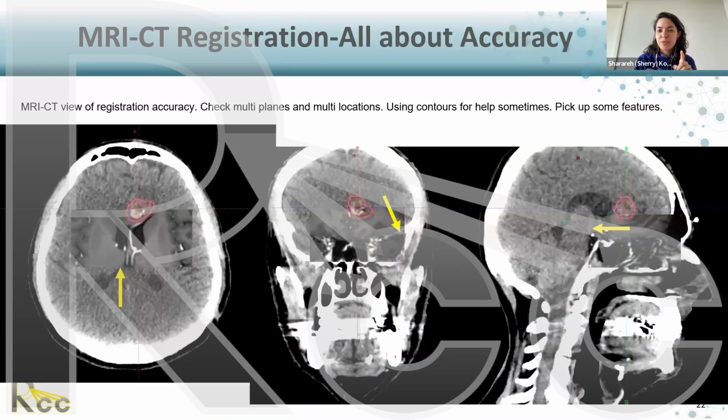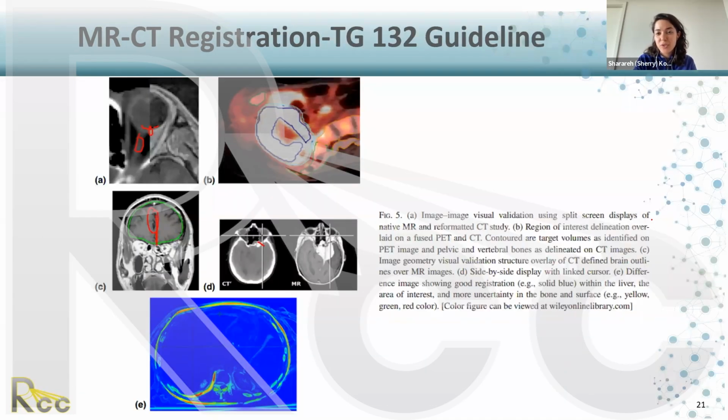Sorry, before we get too far from breast, there's a question about bilateral breast or chest wall treatments, and if there are collision issues, do you have any insights or tricks that can be useful?